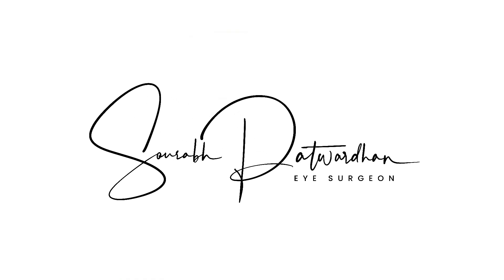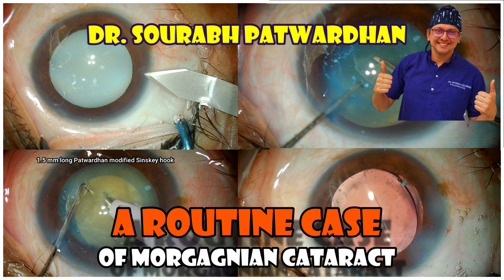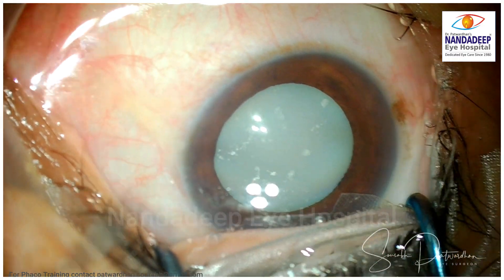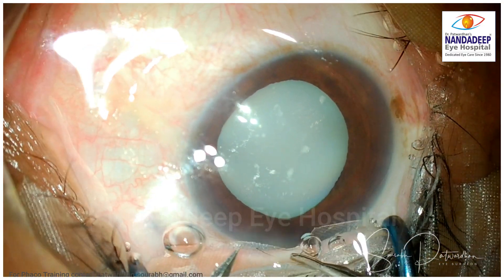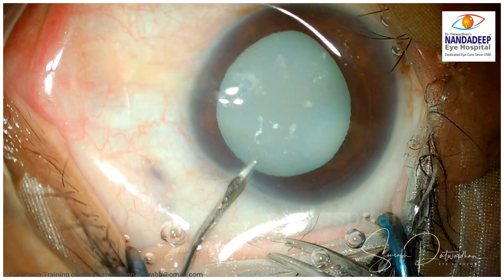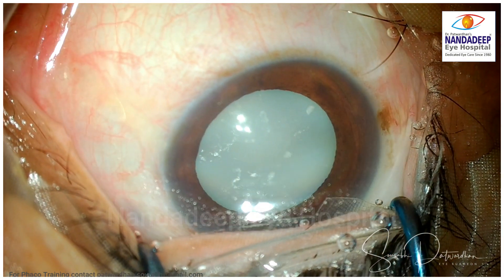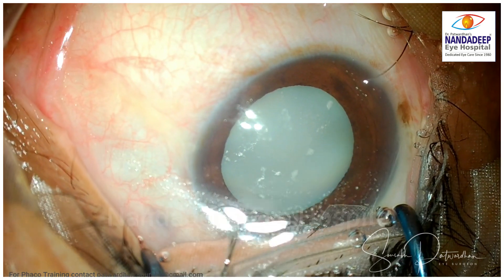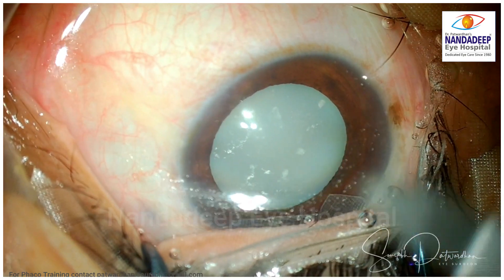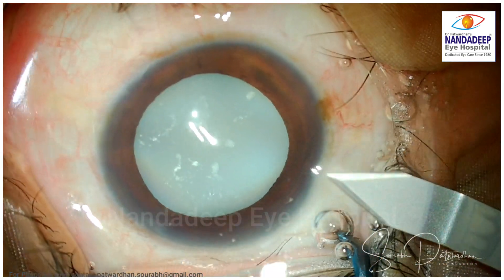In this video, I will be discussing a case of Morgagnian cataract and I am calling it a routine case — and you will be surprised why I am calling it a routine case. It is a complex case definitely, but when you do multiple such cases and you have an established thought process to take care of all the surprises that we may encounter in a complex case, it becomes a routine over a period of time.